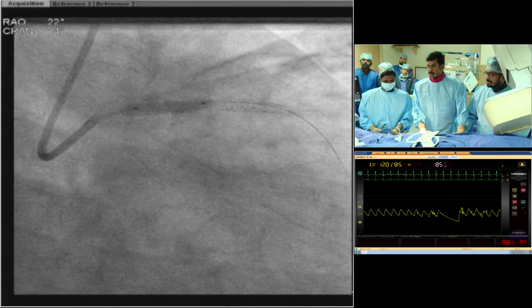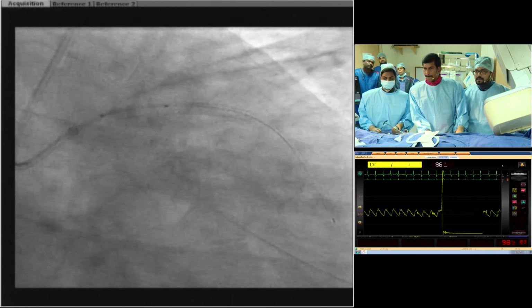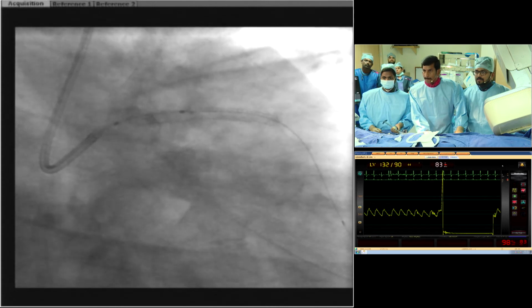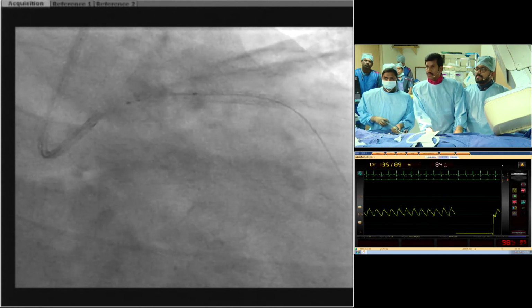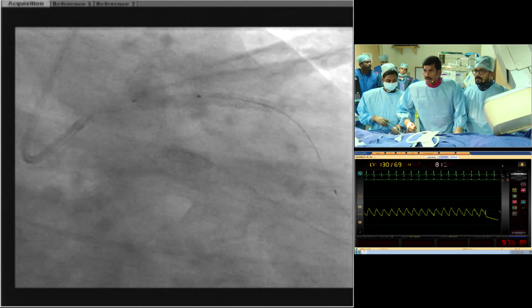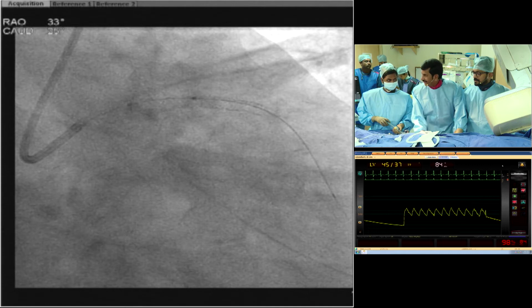One more stent boost. I think we are outside. We'll go back in. On the first day here at C3, we had a talk about the duration of the inflation time when you post-dilated.